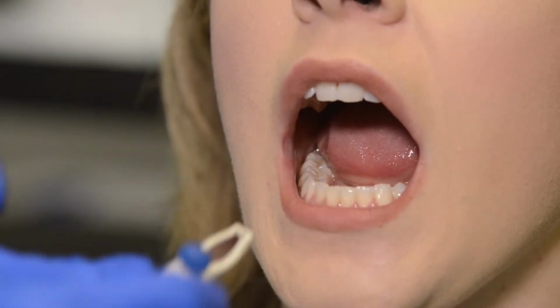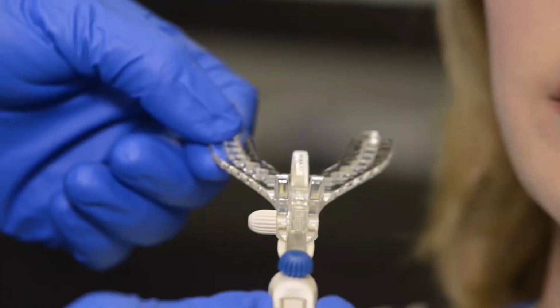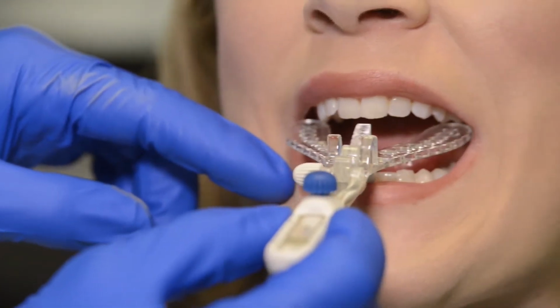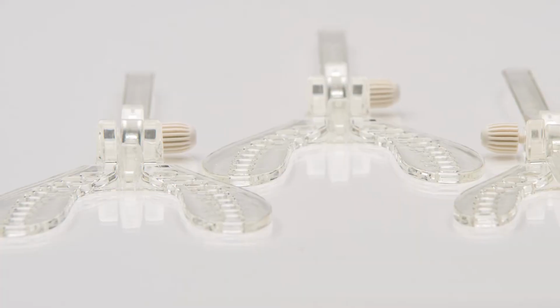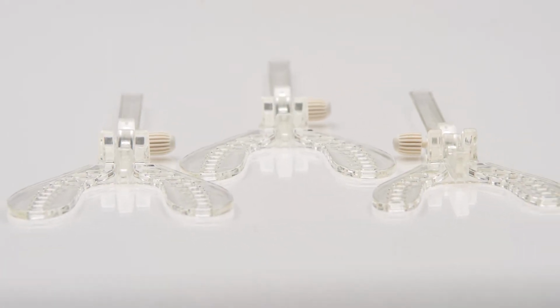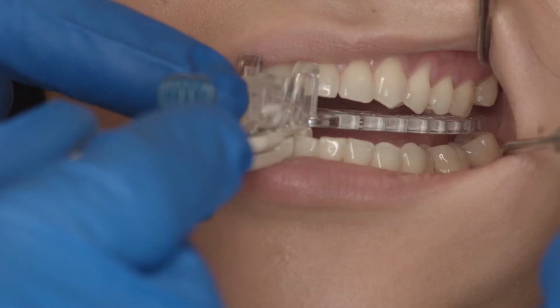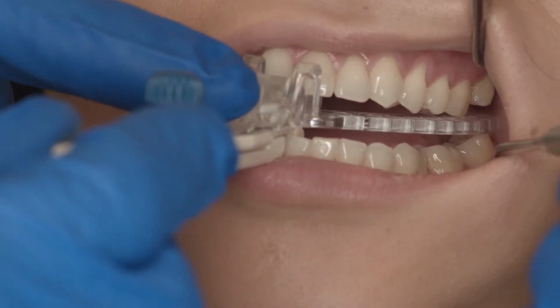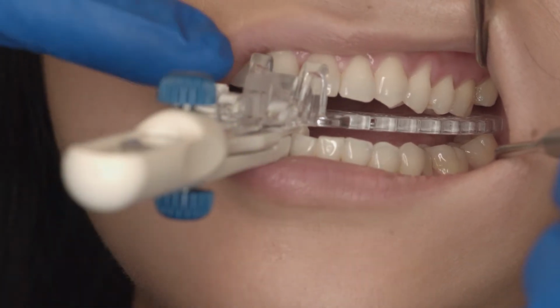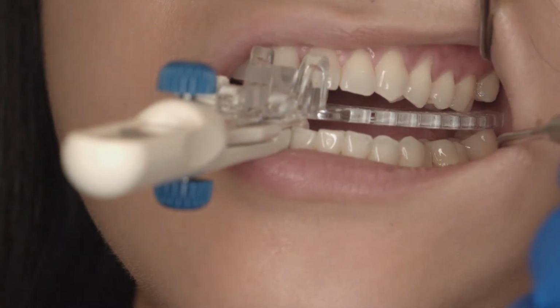Step 2. Remove SOMGauge from mouth, insert the bite fork and reinsert over lower anteriors at the skeletal midline. Choose the bite fork size so that most posterior teeth are at least partially covered by the bite fork. Forks may be adjusted using a handpiece or scoring with scalpel and gently snapping off with pliers if necessary. If a distal wrap is required, the most posterior teeth must be fully covered by the bite fork, which may increase the vertical opening of the bite record.